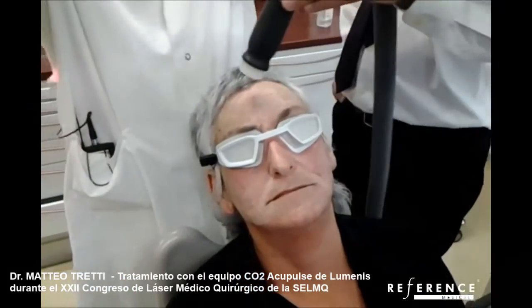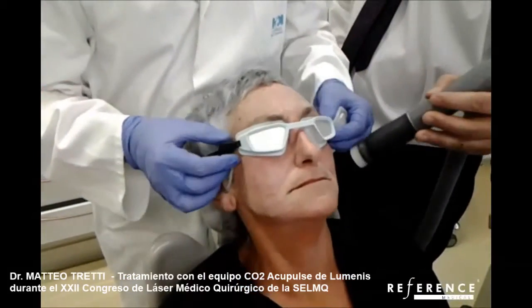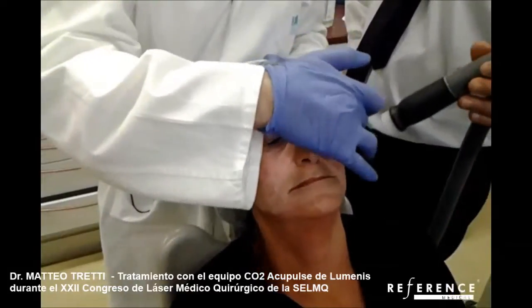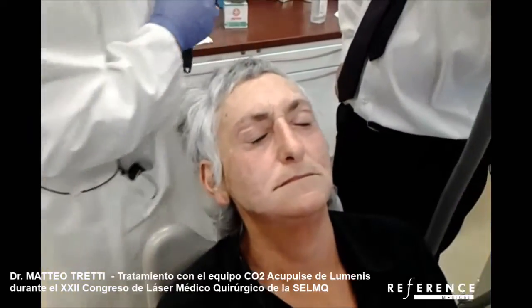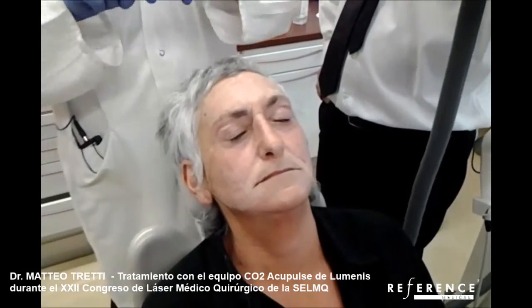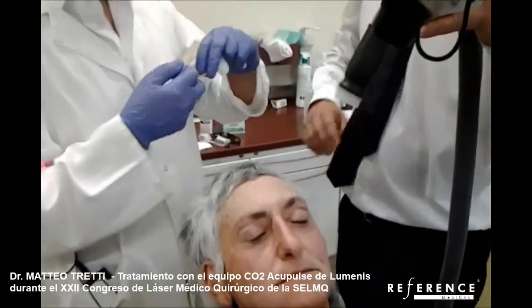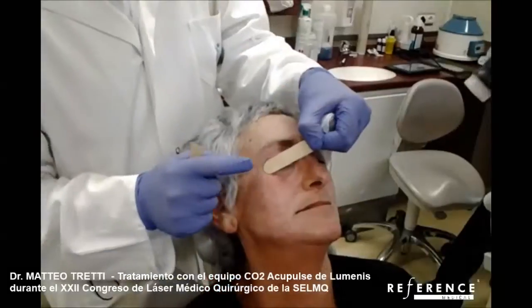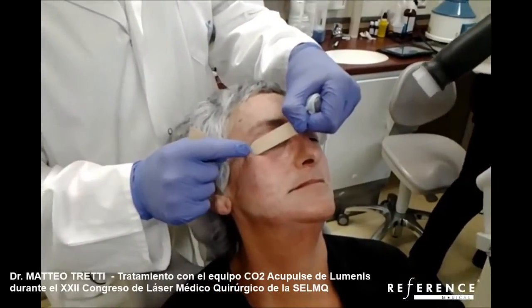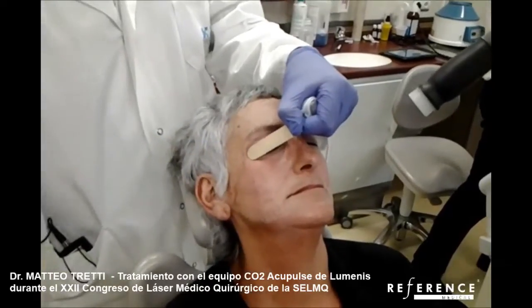Now I have to treat the crow's feet area — this area here and this area here. I don't want to have my goggles in the way, so I ask someone to help me cover. The tip of the tongue depressor is exactly on the bone, so I know where I can go and where I cannot.